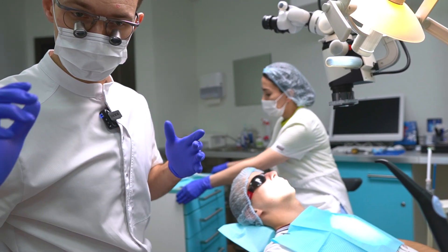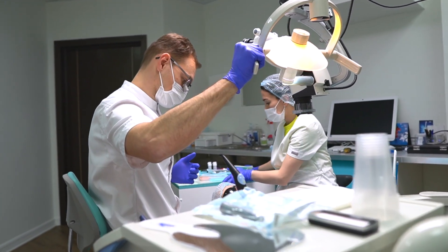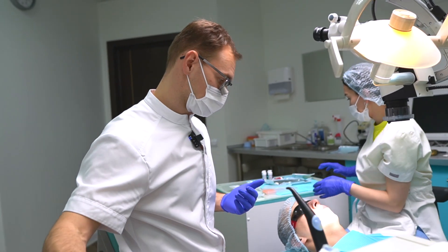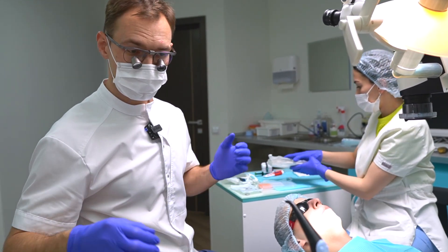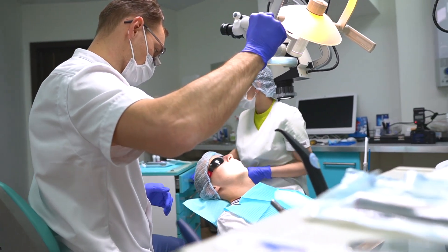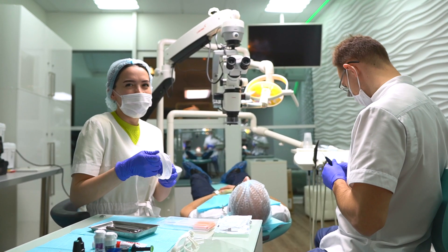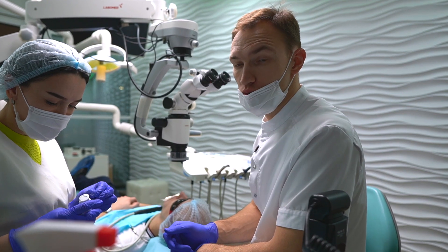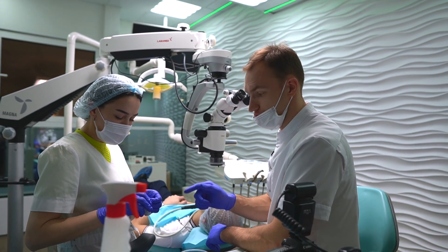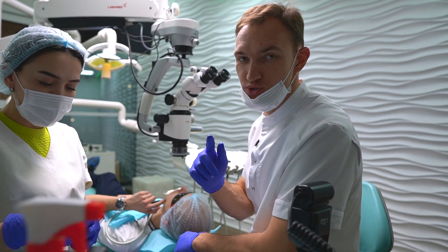Everybody is ready, my patient is ready, and I am also ready. First of all, we have to prepare our tooth, and then we will start to create our CAD CAM crown. Now we are going to install the cord into the gingiva to have a perfect margin to scan.